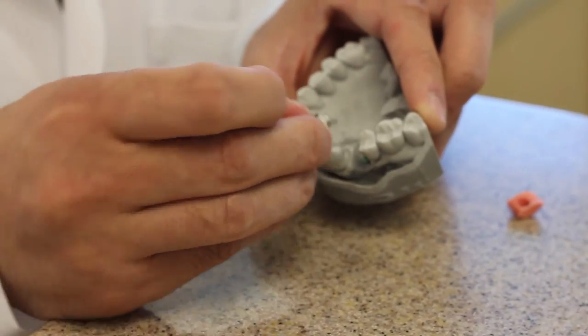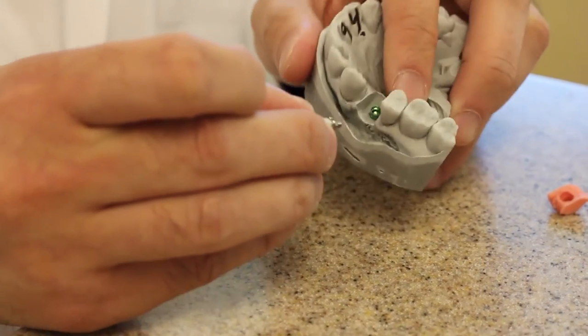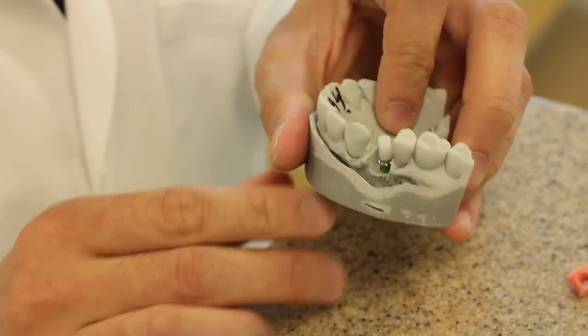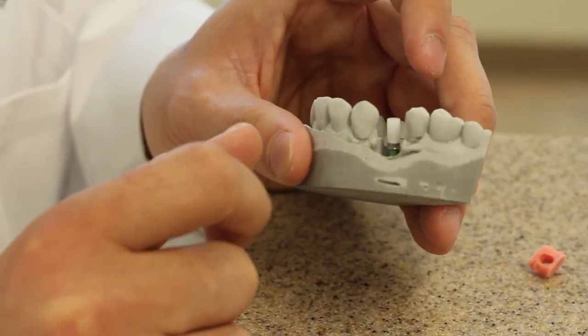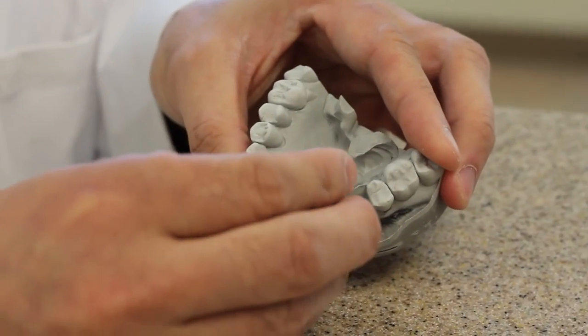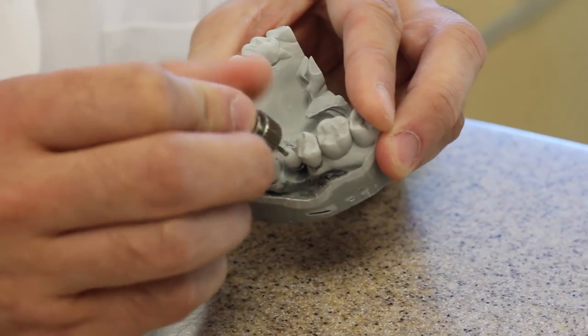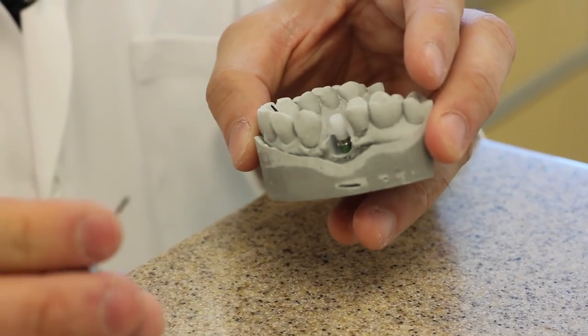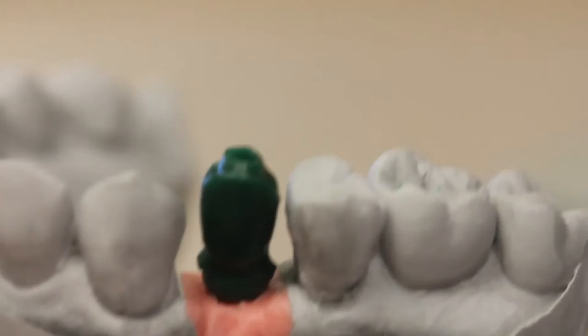What's being seated onto the analog now is what we call a UCLA abutment. It's got a plastic sleeve on it that we can wax up to the contour of the crown that we would like to fabricate. Tighten that and see that it is seated all the way. It's important, otherwise our occlusion will be incorrect if our crown is fabricated off of an unseated or not fully seated UCLA. You'll give that to the lab.